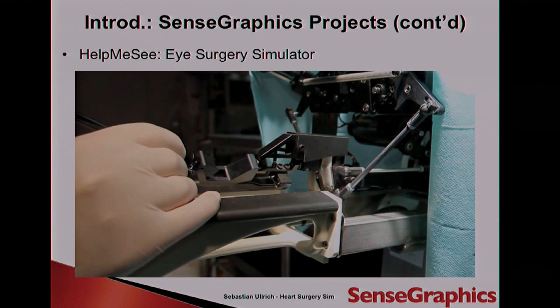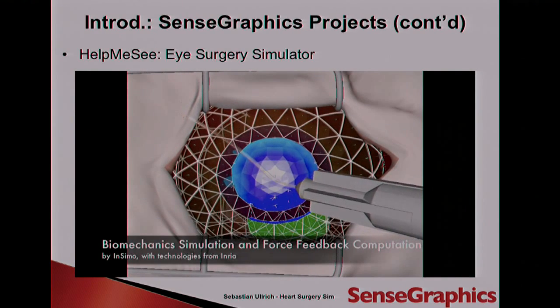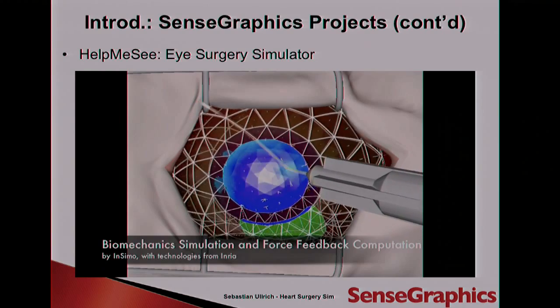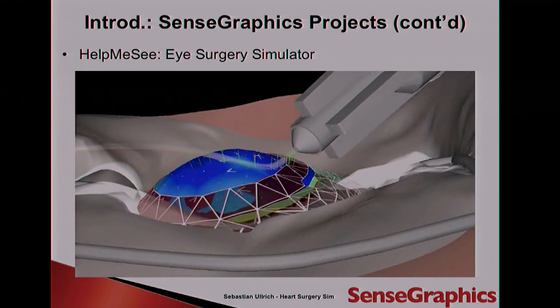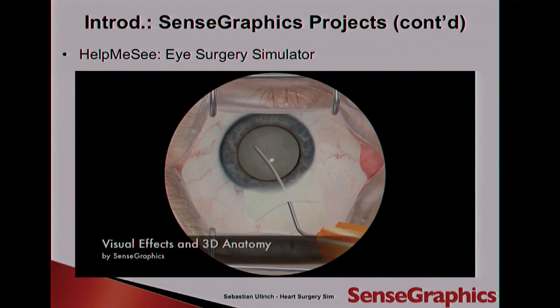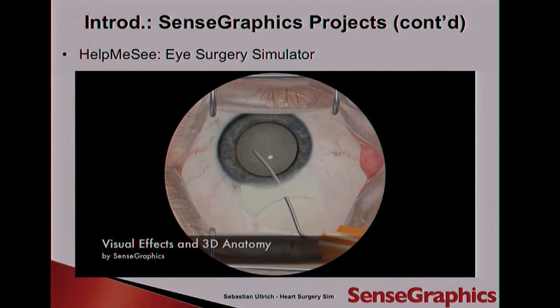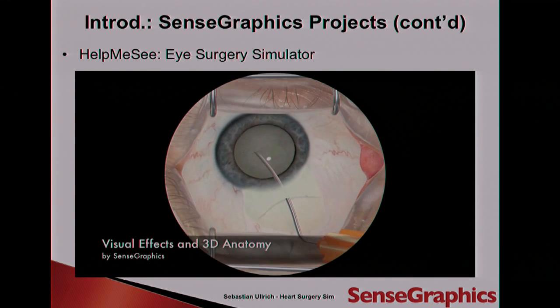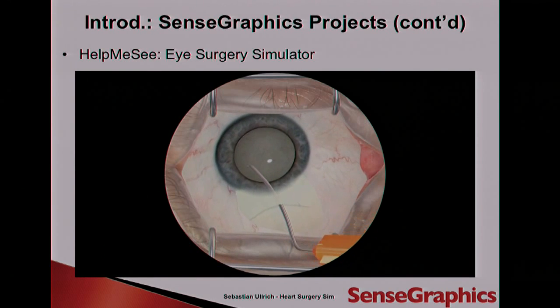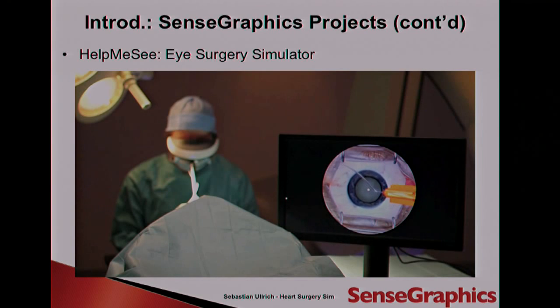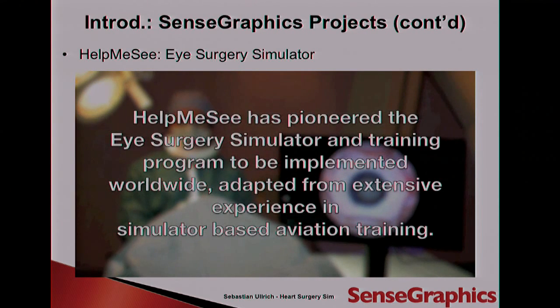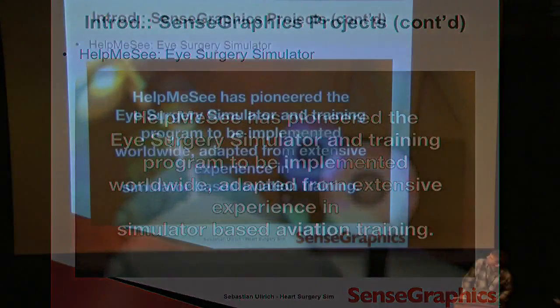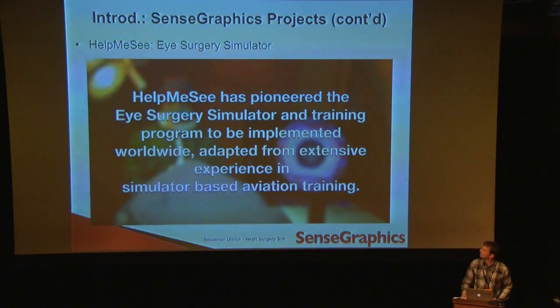Here you can see a haptics device which you can use to control the instrument and feel forces. This is the simulation mesh with force fields and so on, and this is the rendering — all happening in real time, which is quite a challenge to fake all the reflections. Right now we are also adding fluids.